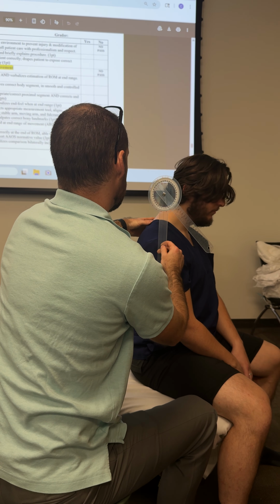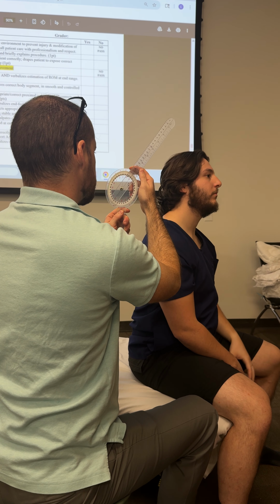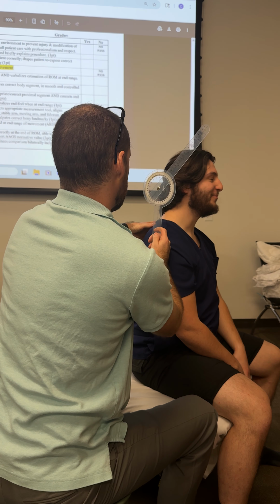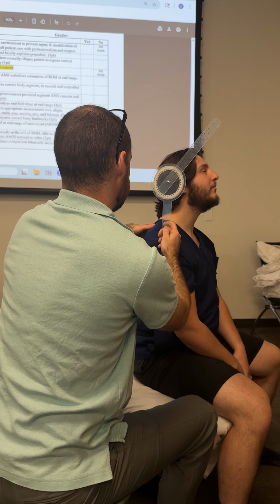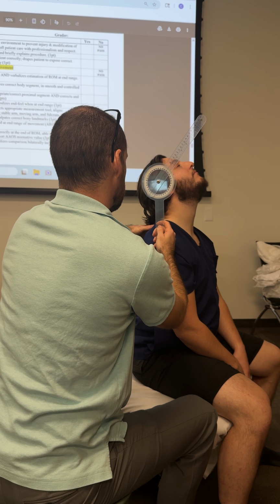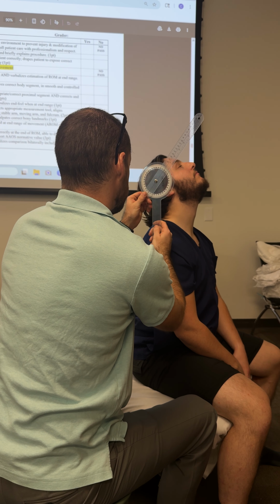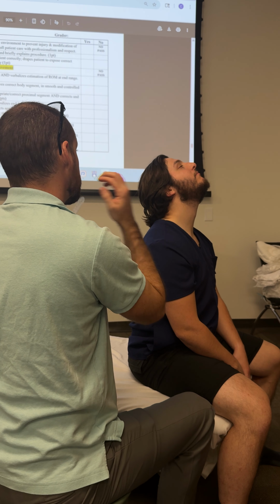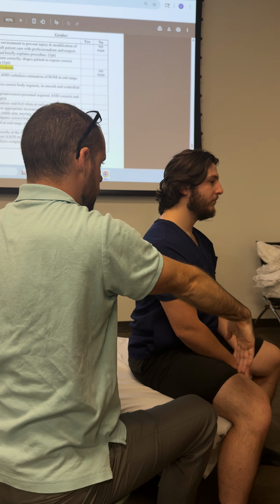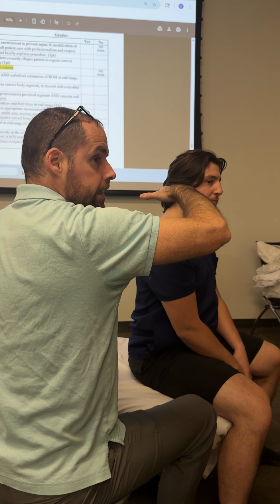Come on back up. I'm going to preset 45, actually 40, in the opposite direction. Okay, and then go ahead and look up towards the ceiling. Perfect, and he actually went a little bit further this time. So he's at 43, maybe just a little bit more than normal going into flexion, just a little bit less going into extension. I'm not going to overpressure the extension.